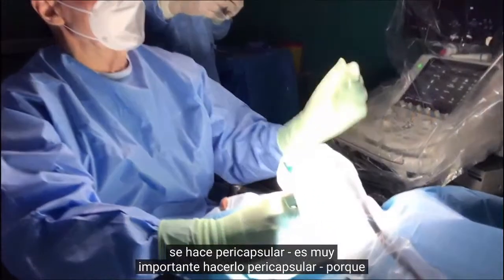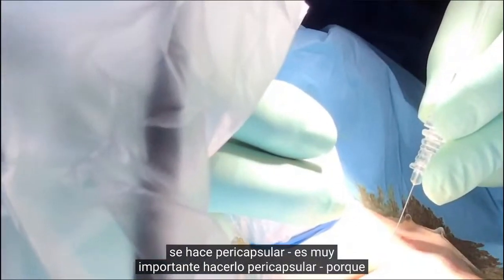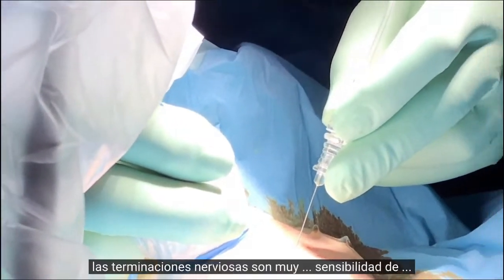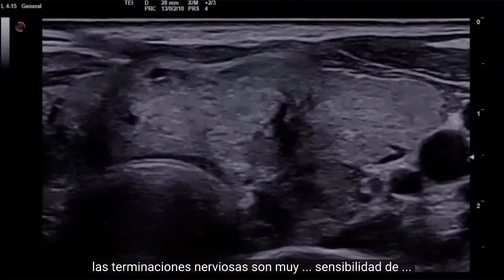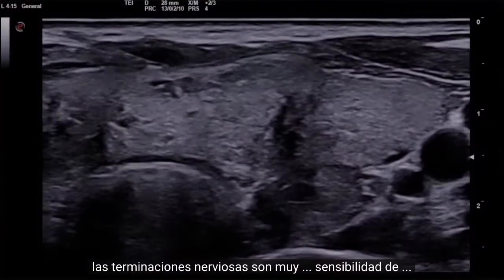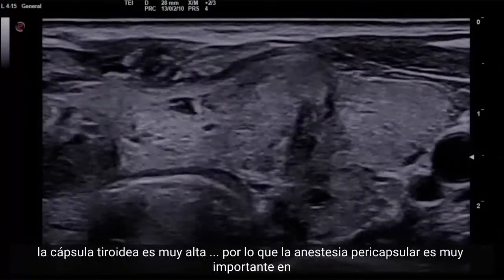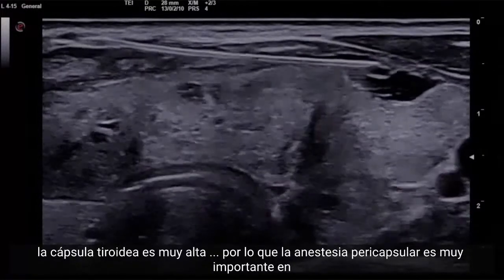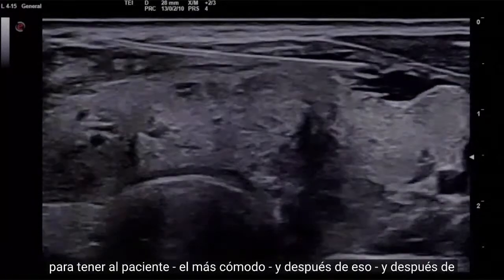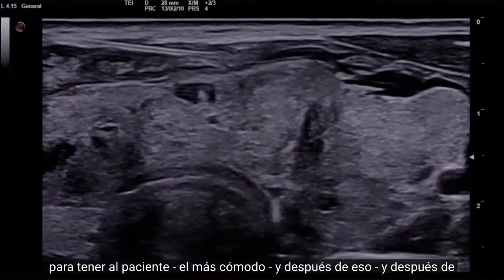It is done pericapsular. It's very important to do it pericapsular because the nerve terminations and the sensitivity of the thyroid capsule are very high.